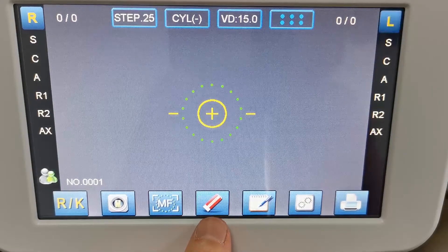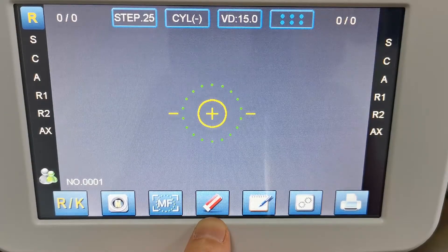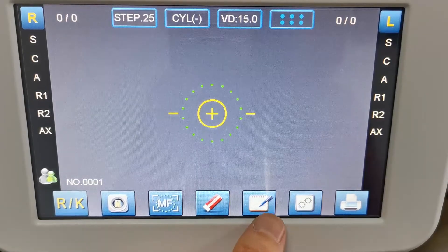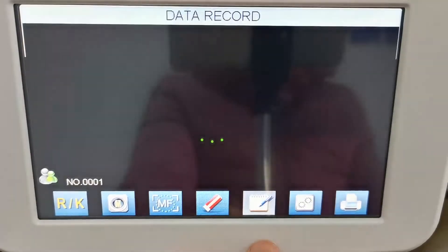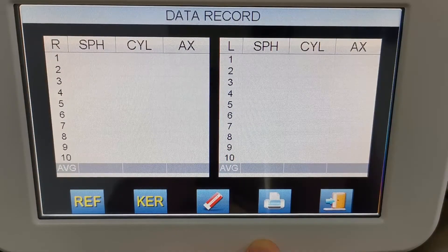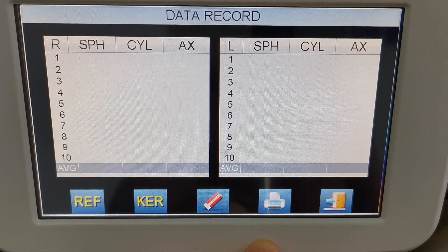This is an eraser to clear all the data measured. And here is to check the measuring data, so you can see the right eye and the left eye displayed together.